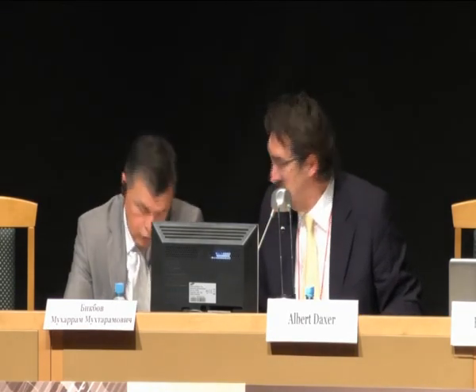And a second question, if I'm allowed. What is the reason for the aging of the implants, that they don't work anymore? This is a very tricky thing, because to get the information very close to the target, you have to expose the electrode. And the chip is like a real working computer. There is a lot of electronics beneath this electrode. When you try to coat the electrode, you always have a part where it's open. It's like when you have a filling in your teeth, you always get problems there. Macrophages and other fluids can degrade the function of the chip, and that's what we have to work on: additional passivation so that the chip lasts longer.